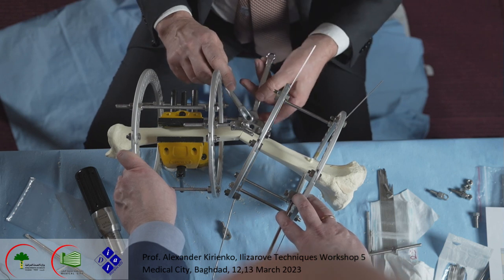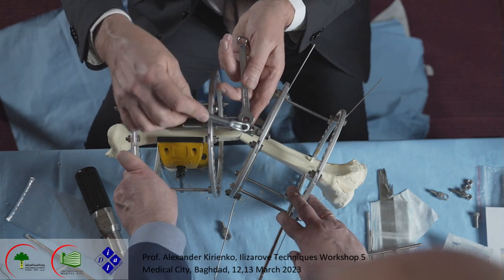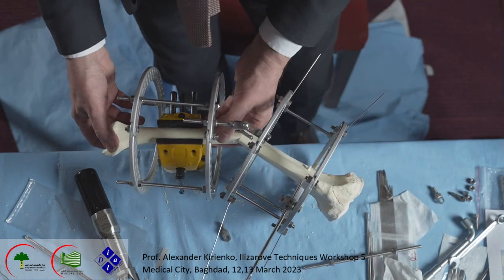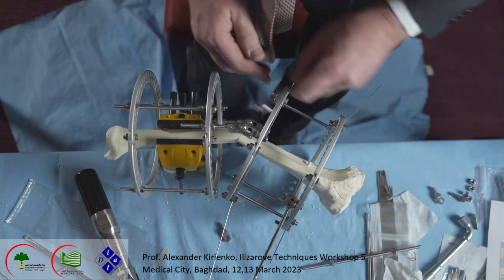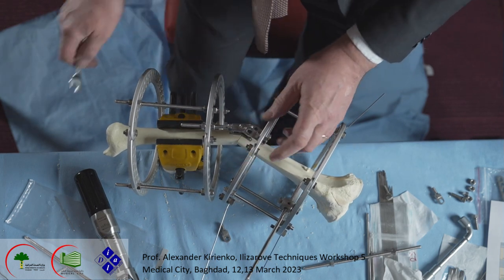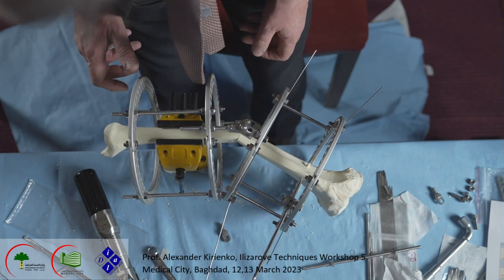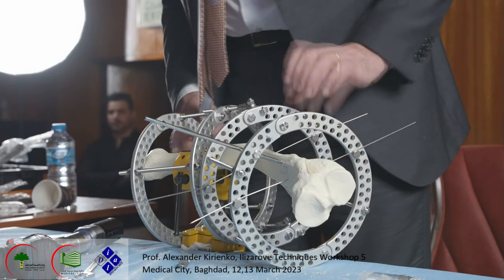And you realize how big the deformity is. Monoplanar, but a big deformity in varus, like you see here now. Okay, but it's not enough again. Okay, in this way you practically touch it one to another. Perfect. Now, if you want to see it in fluoroscopy, we may control it.